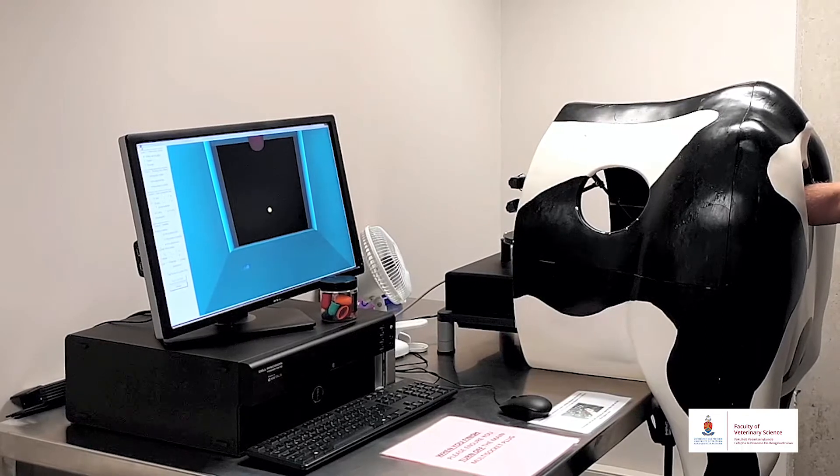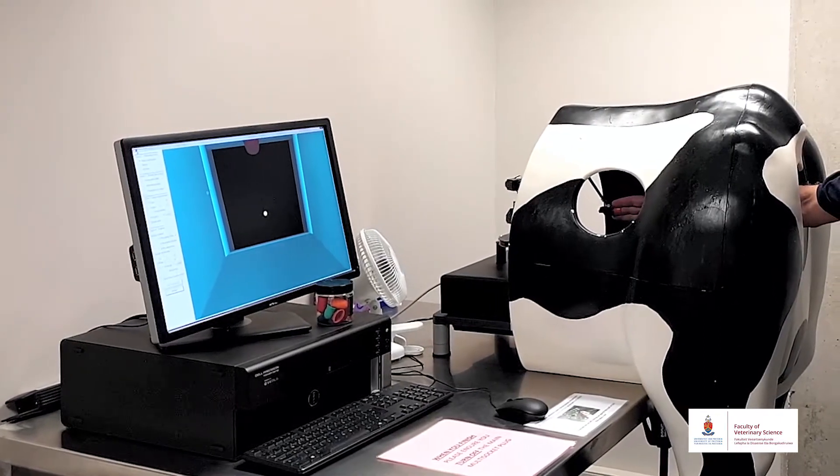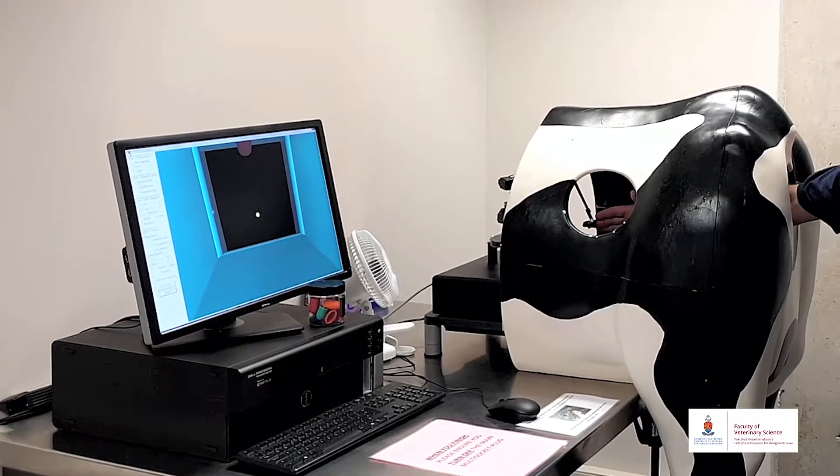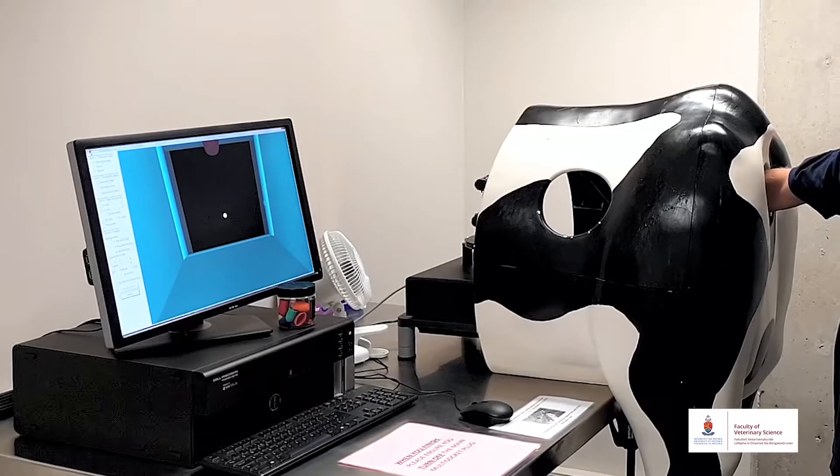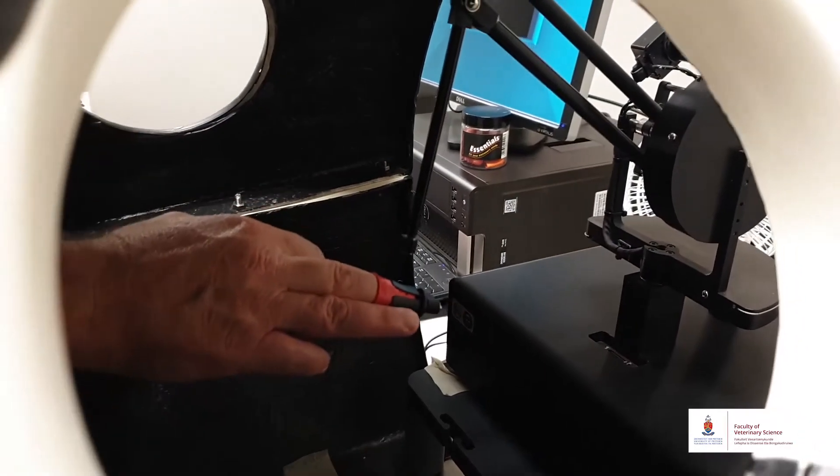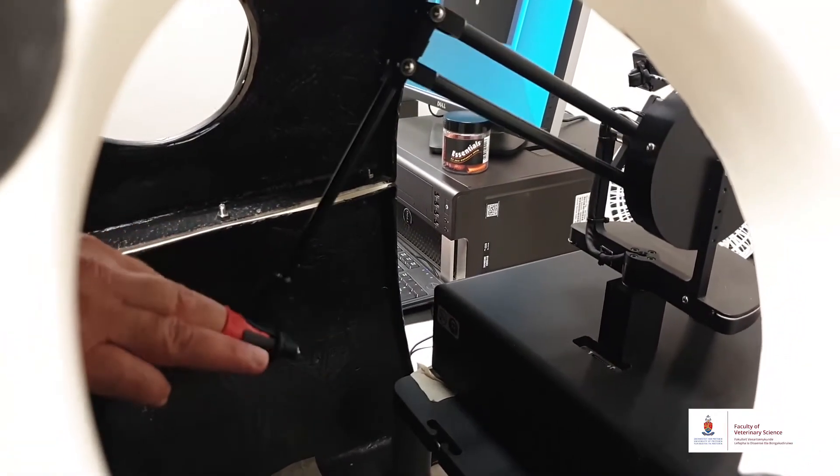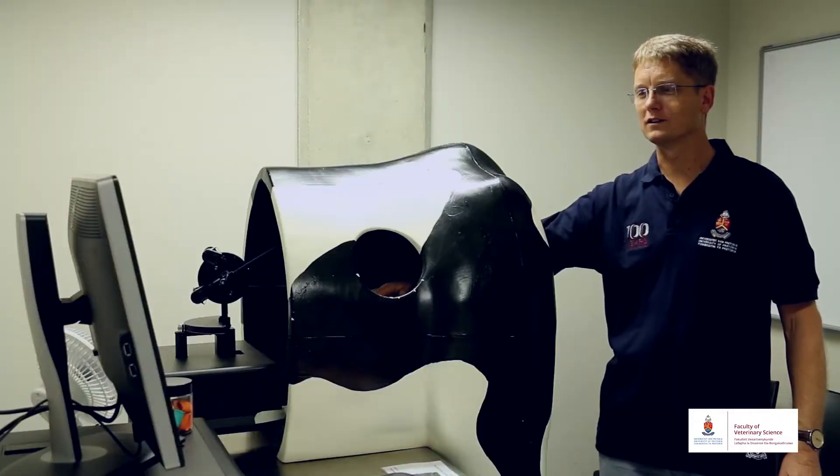You can see how the computer controls my hand so it stops me when I try to get too far and it shows me where are the edges of the pelvis that I can palpate. Palpate means I can feel with my hand inside the animal.